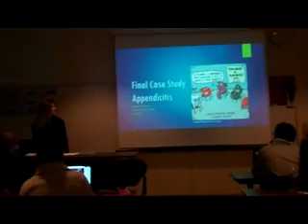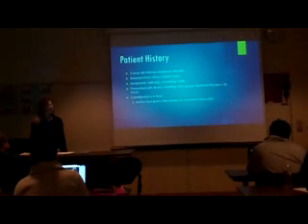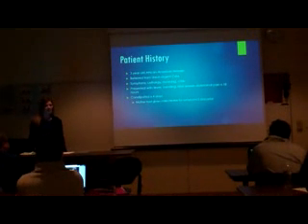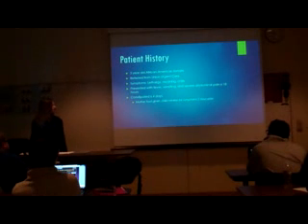Acute appendicitis. And these images are all from CMC Union. My patient was a 3-year-old African American female, and she was referred from Union Urgent Care to CMC Union. She presented with symptoms of lethargy, moaning, and chills.